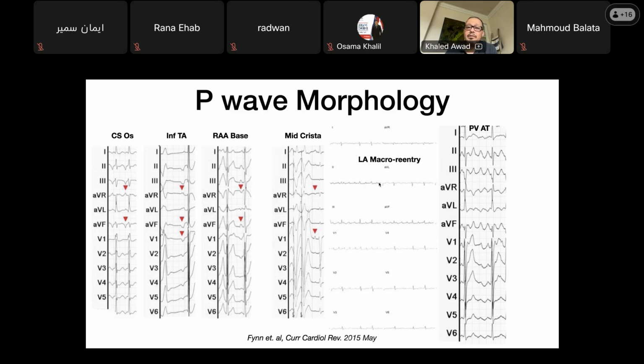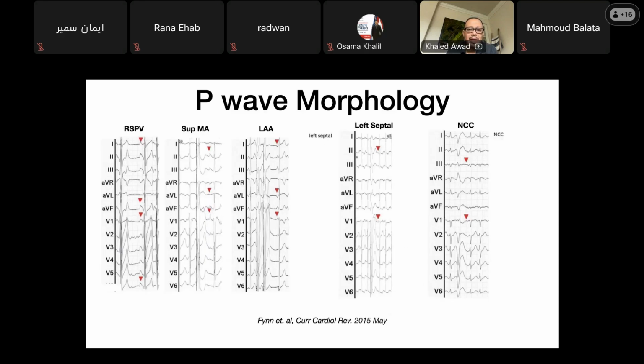So tachycardia versus flutter, what we're talking about today is atrial flutter, but it really is the same thing. They're all a continuous syndrome, and you don't know what you're getting yourself into. Now, if this is a healthy person who only has that and has never had an ablation before, common things are common. It's probably an atrial tachycardia arising from the coronary sinus ostium or the crista terminalis. Or someone that had multiple ablations before, well, most likely it's re-entry. But don't pin yourself to a particular idea before you get in.